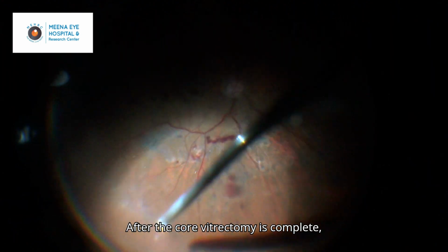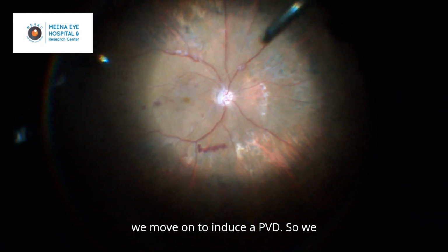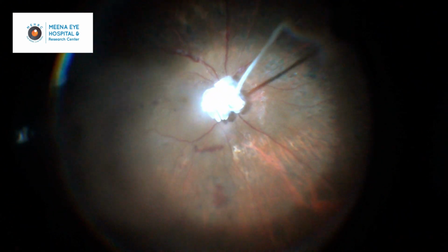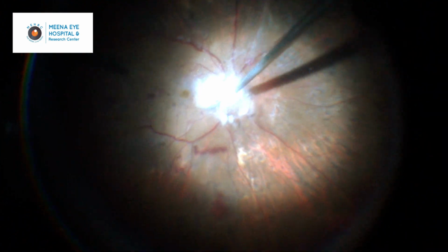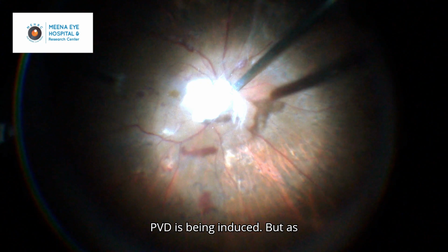After the core vitrectomy is complete, we move on to induce the PVD. So we stain the vitreous with the help of triamcinolone. We start with inducing the PVD from the disc inside out. So the central PVD is being induced.